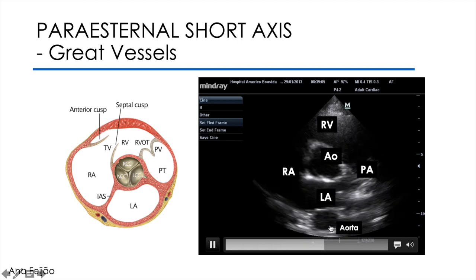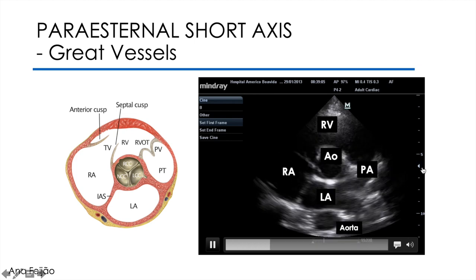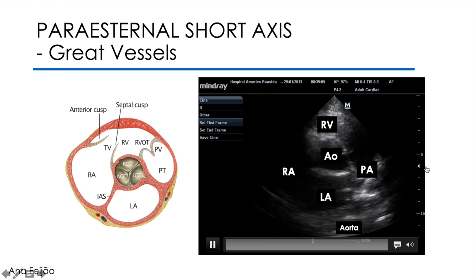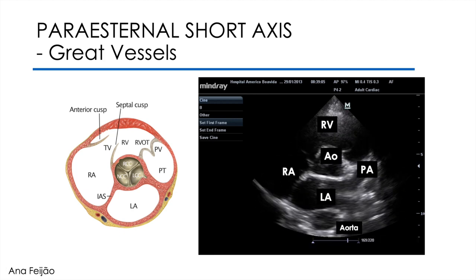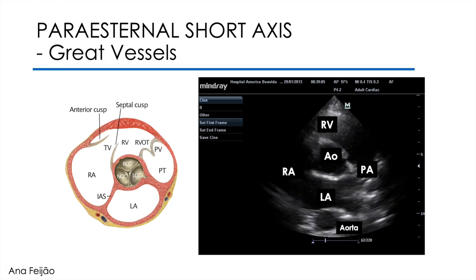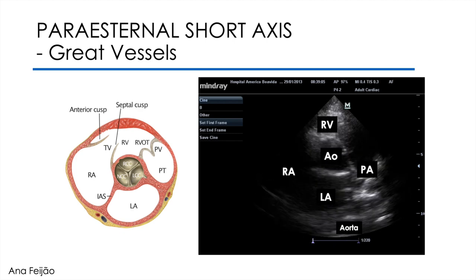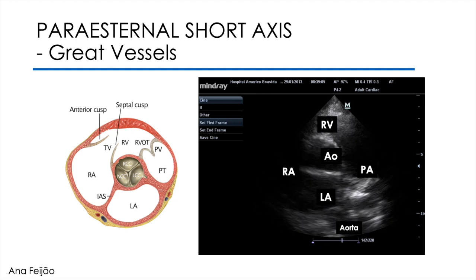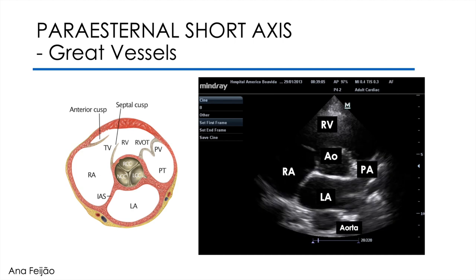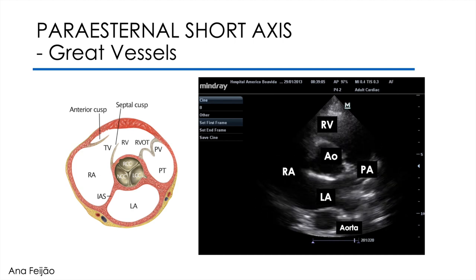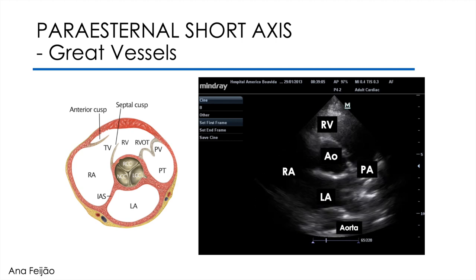We must orient the focus and the gain ramp according to the bidimensional grayscale variations, and we improve the image with small tilts. As it is an incidence with so many structures, we may have to make small tilts on the probe to better define the exact area that we want to study. We are not always able to have a perfect image with all the structures well visualized, so the ideal is to start by evaluating step by step.